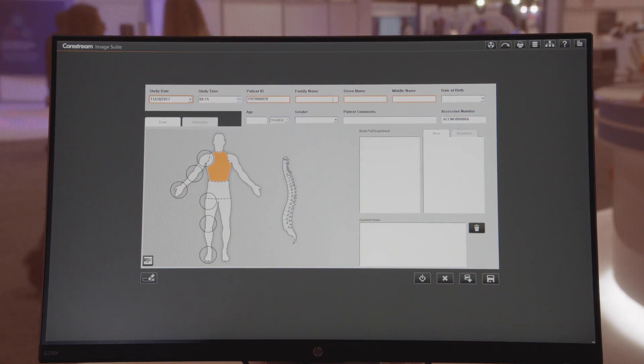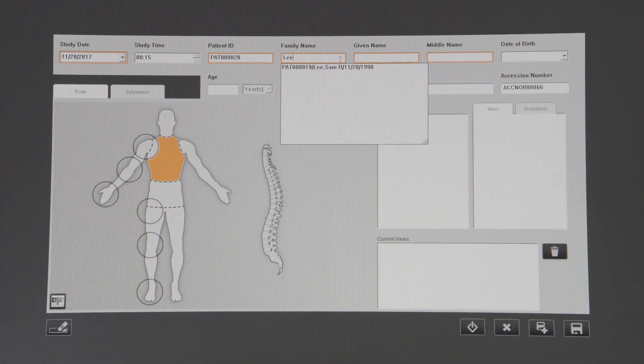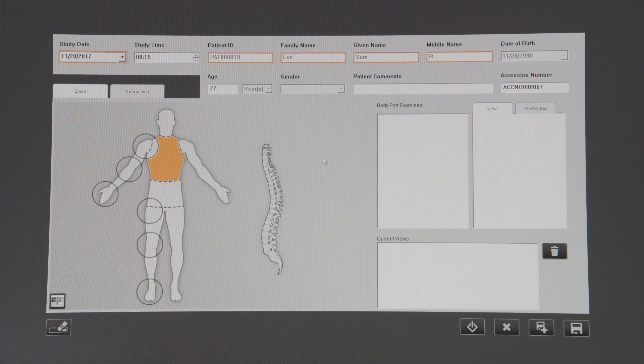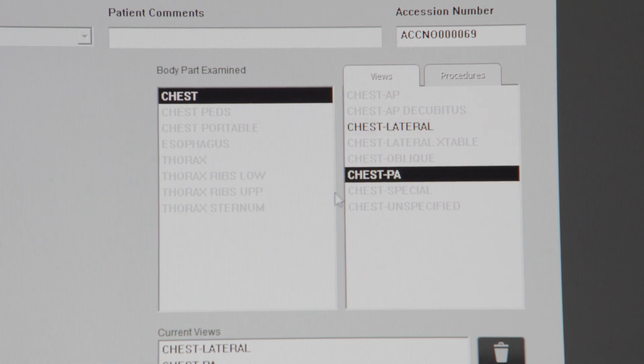Entering patient data is quick and easy. Simply type a name and you'll get a drop-down that allows you to complete the information. Select the anatomy that you wish to examine, the views that you want to acquire, and then start the exam.